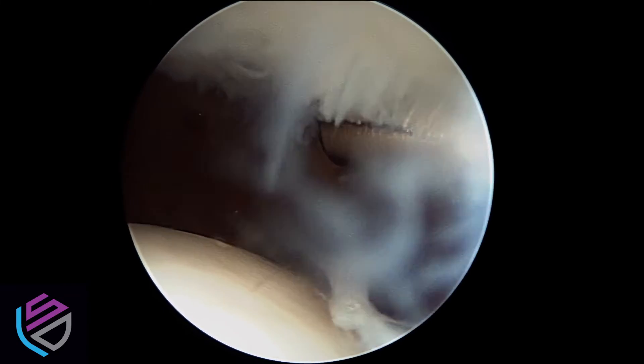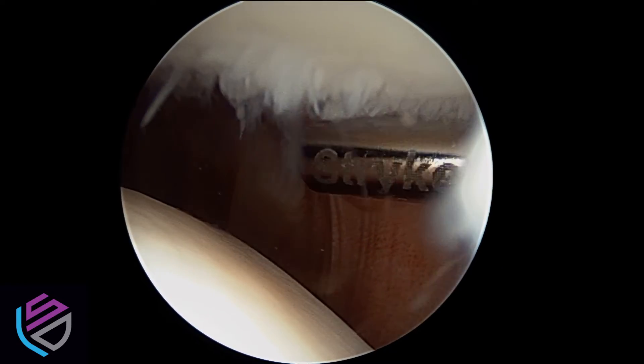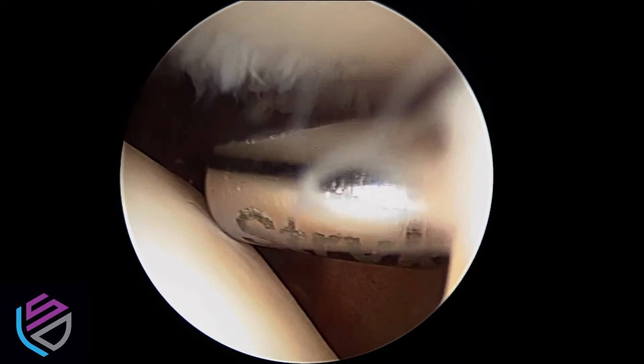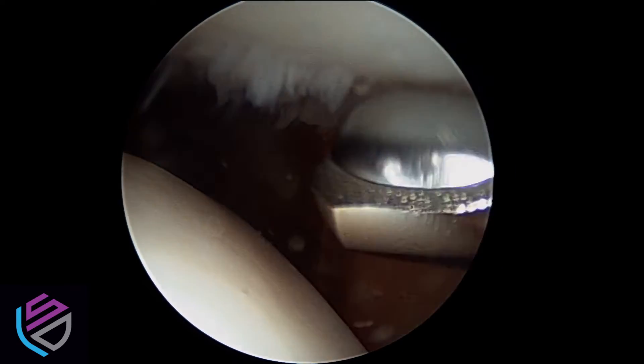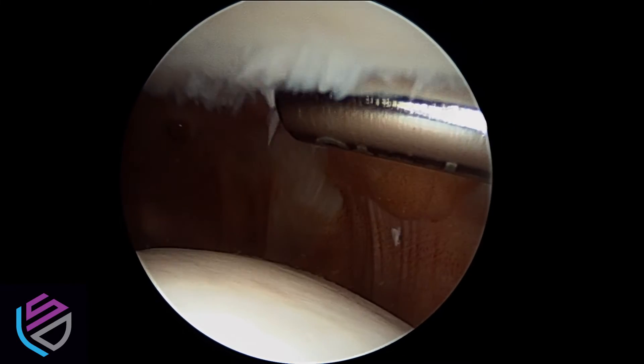Surgical treatment includes using this arthroscopic shaver to remove the loose and damaged pieces of cartilage from the back of the kneecap. Damaged cartilage is a precursor to arthritis and it can also cause a lot of crunching, swelling, and pain in the knee.